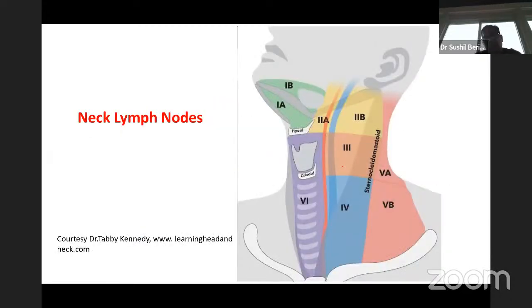Now, this was part of the discussion in terms of lymph node level. In the new nomenclature, we follow a nomenclature which is a lot more standardized now. So when you're defining a node, you can follow that nomenclature in your practice. And as defined by the previous speaker, the different levels of the node.